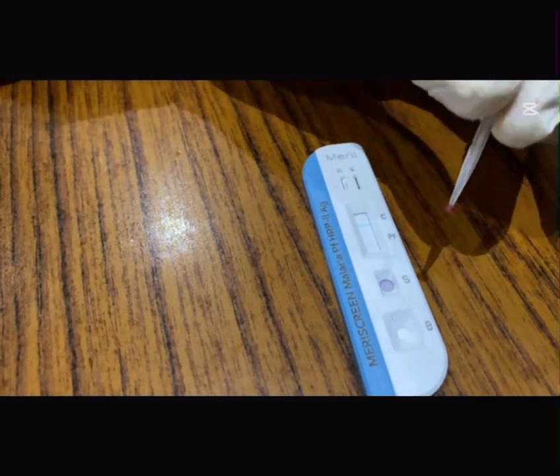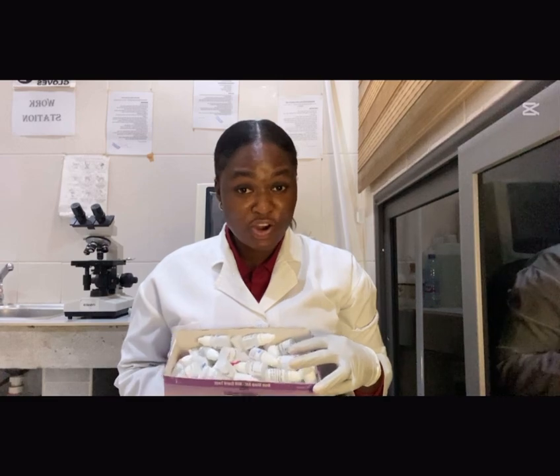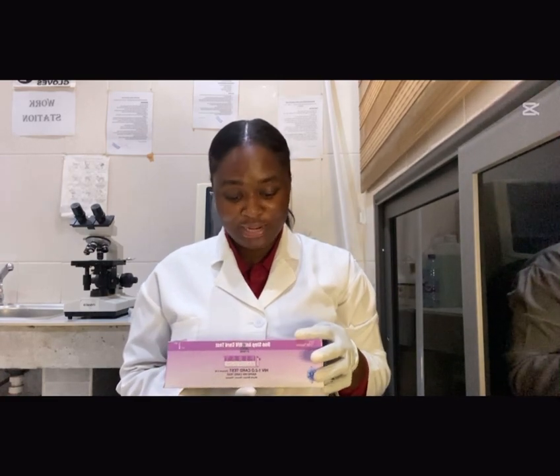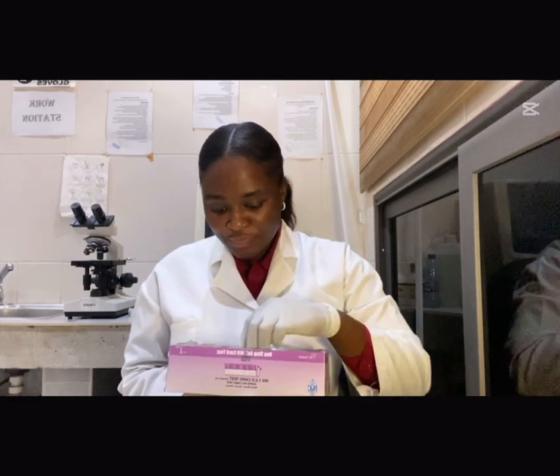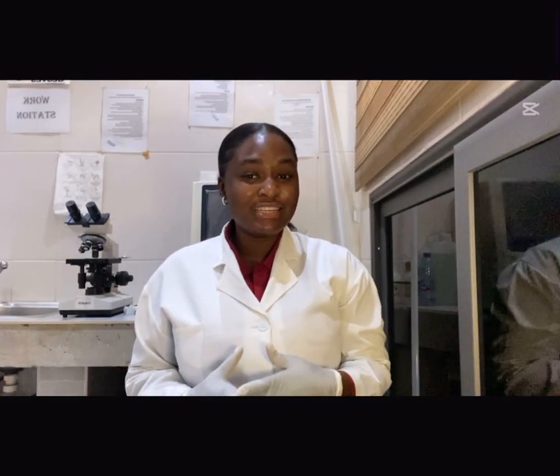So the blood goes into the S well and the buffer goes into the B well. Note that some test kits actually have the blood and buffer going into the same well, so always follow the kit instructions on where to put each of them, as well as the number of drops of buffer and blood to use — too much blood or buffer can interfere with your results. Also, always make sure you're using the right buffer for the test you're performing, especially when you have multiple test kits and buffers around. Always read the labels on the buffer to confirm.